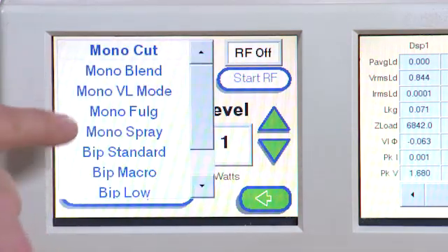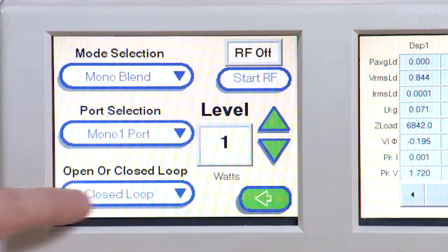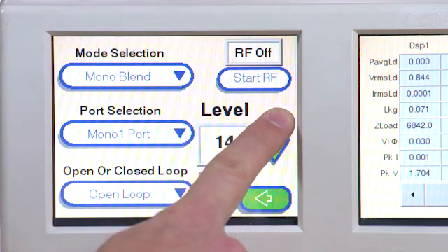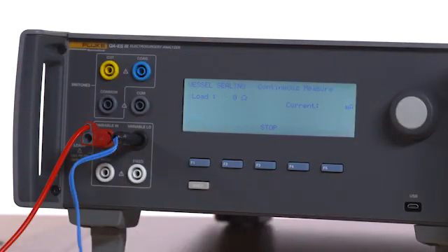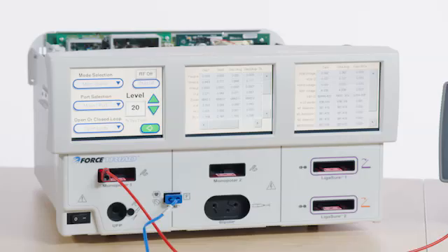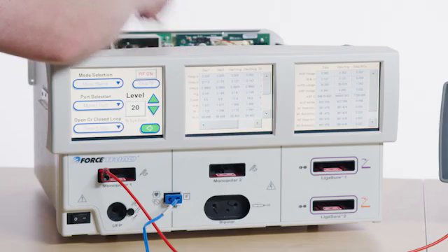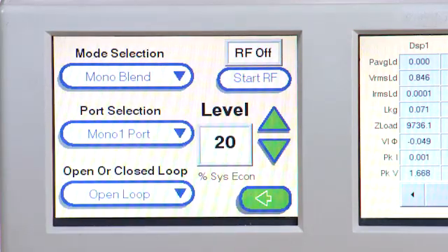Select Diagnostics and then Debug Mode. Select Mono Blend from the drop-down list. Choose Mono 1. Select Open Loop. Set Level to 20% using the Up button. Press F4 for Start Continuous on the QAES-3. Select Start RF on the Force Triad. Adjust the Inductor Potentiometer located on the HVDC-PCBA to get the lowest possible reading on the QAES-3.